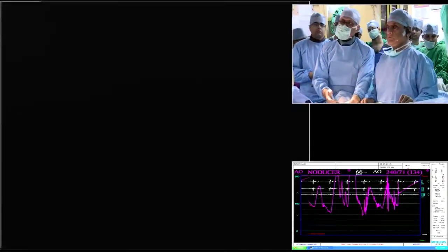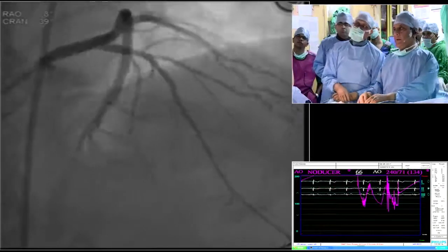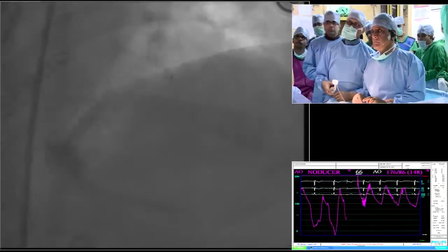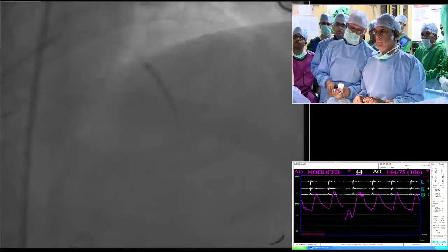Okay, we'll come back in the guide and then take a picture. No, let's take a picture. Yeah. The middle still remains a little dent. So let's go back. Go up here. 14, 22, 22, 22. Good. Negative.